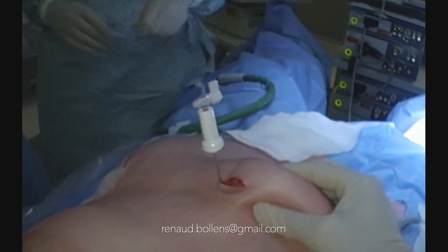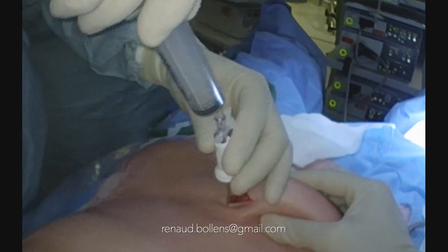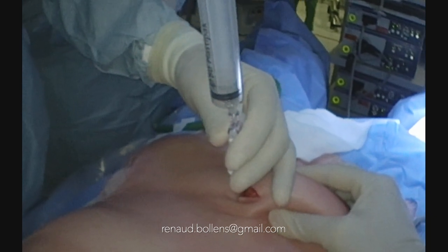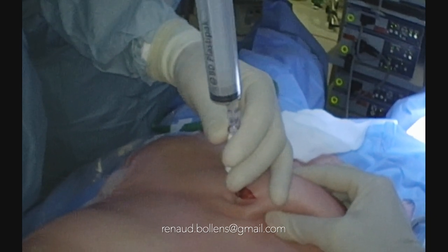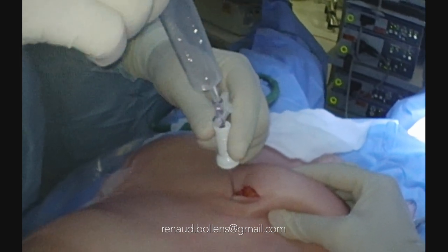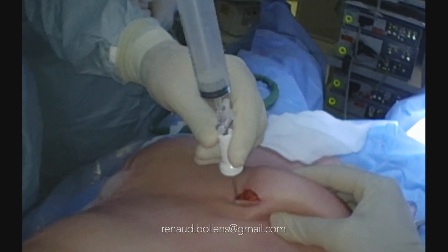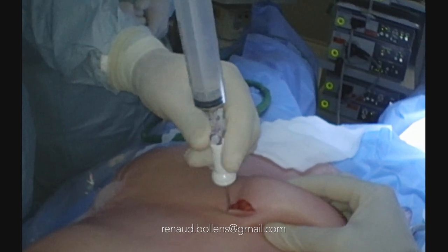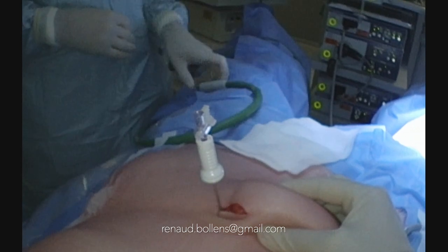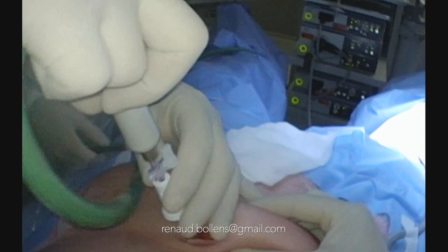Now I do a test with the syringe. The first thing that I do is I suck inside the syringe. If I see that I have air coming out, I'm inside a cavity like the colon. If I have blood, of course, I'm inside a vessel. Now I just inject 20 milliliters of air and I try to suck up the gas. If I cannot suck up the gas, I'm inside the peritoneal cavity. If it's possible to remove the gas, I'm in a closed space and usually it's not the peritoneal space.